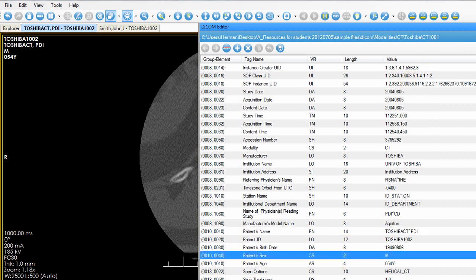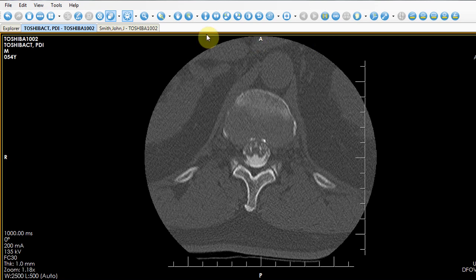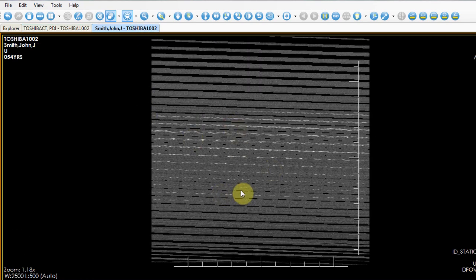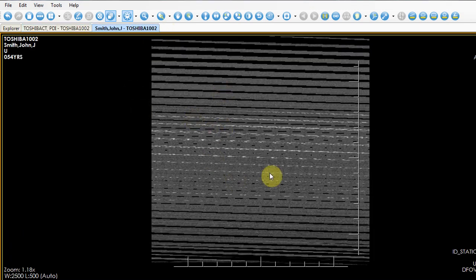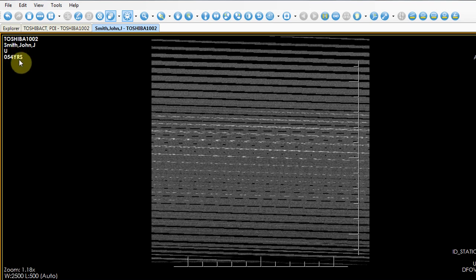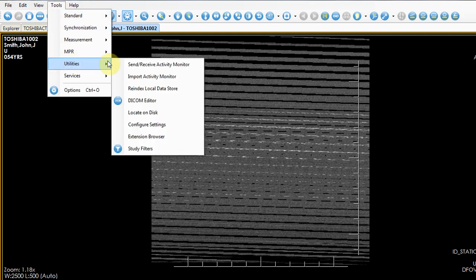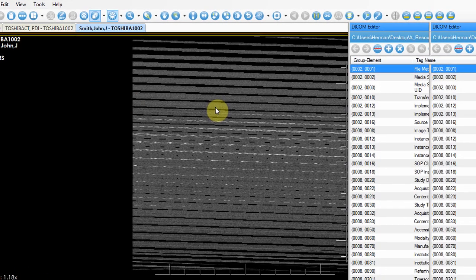Now if you have a problem image, we do exactly the same thing. Here's a problem image — you can see it's totally distorted. This is called a John Smith image, and it's totally distorted, so there might be some issues with the patient header. There are some unusual values showing — unknown sex and some different information for the age as well. Again, we do exactly the same thing: call Utilities, DICOM Editor, and see in the DICOM header what might be wrong.